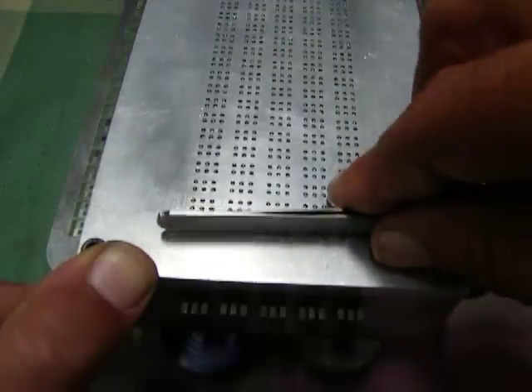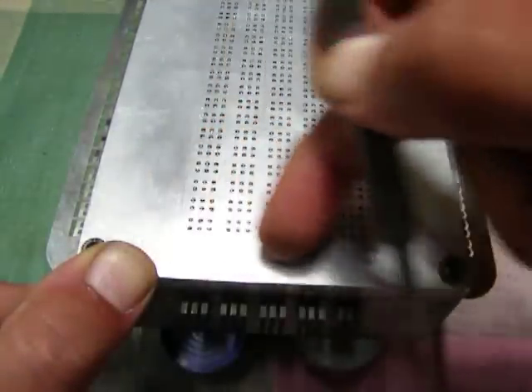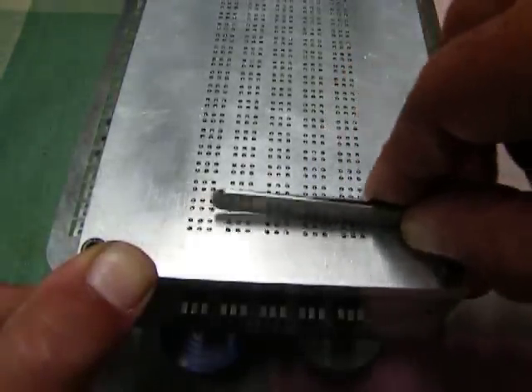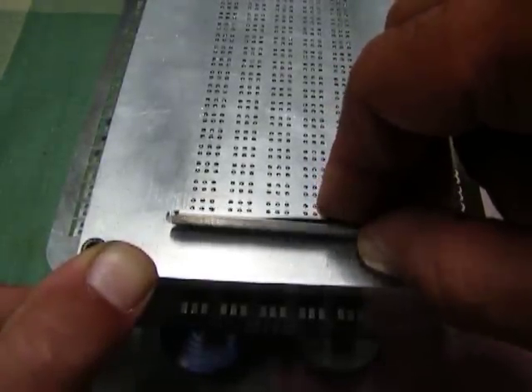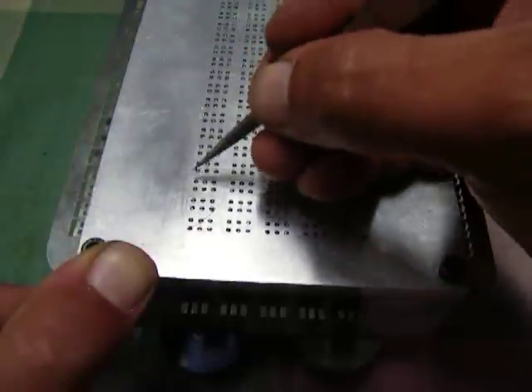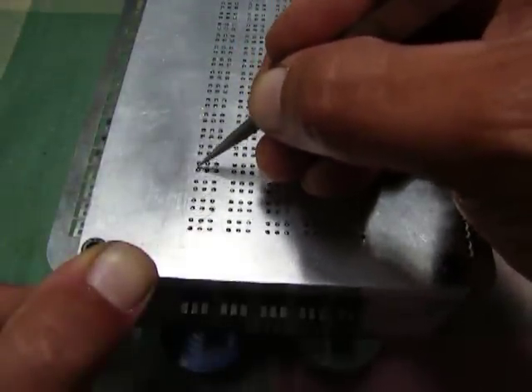I've got to do an entire column at a time. So if I had to set the information when I'm using the display, I would set all the information in this first column simultaneously.